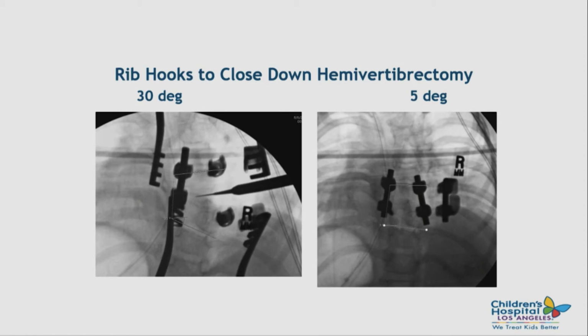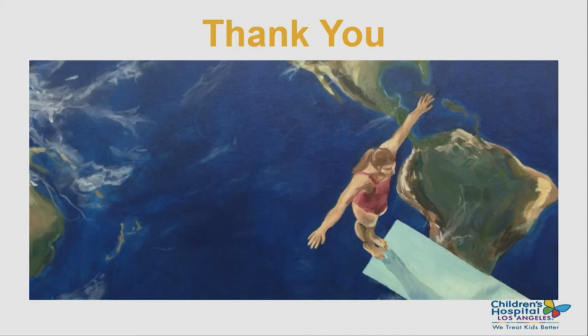So another time you could use rib hooks in a special situation is if you have a hemivertebra, you take out the hemivertebra. If you try closing that down with pedicle screws, often the screws would plow. So in the thoracic region, you have the luxury of putting a rib hook above or below, doing all the compression on your ribs, and then placing the screws, and that would save the screws from plowing. And you could either leave that hook in for a while or not, either way. That's it.